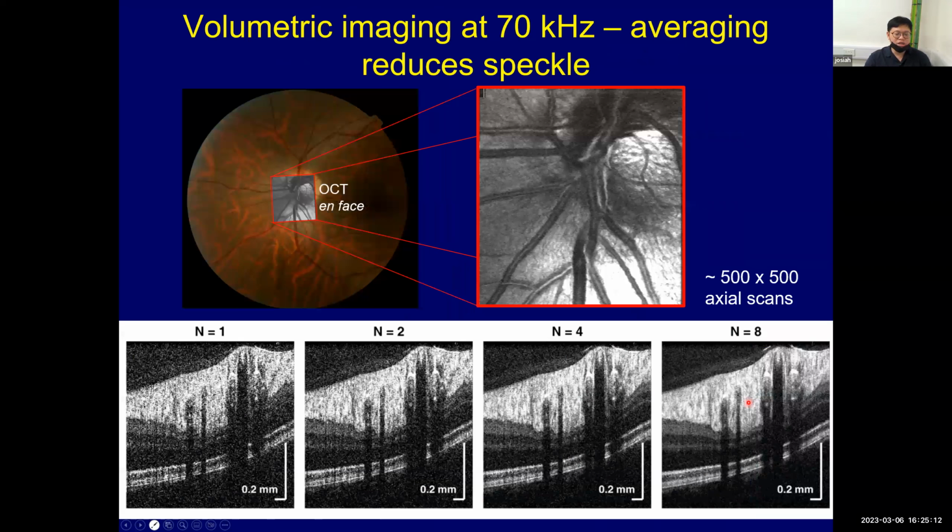So some of you may have heard about fundus imaging. This black background and circular view is taken from fundus images. Basically, you can use a camera to take a snapshot of your eye, but as you may expect, this kind of technology doesn't give you depth information. So what you get is 2D information, but it still gives you a lot of information about your eye and your vasculature, in the sense that it can be a very quick and non-invasive diagnosis method.